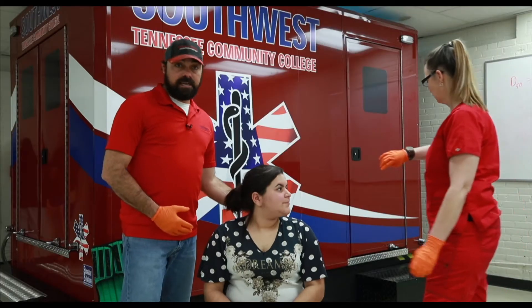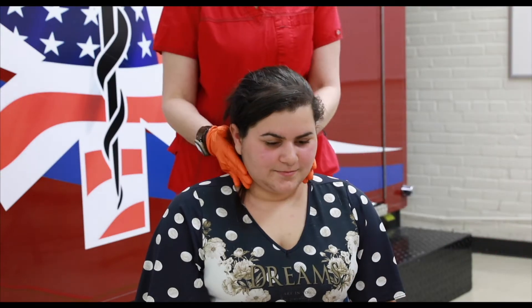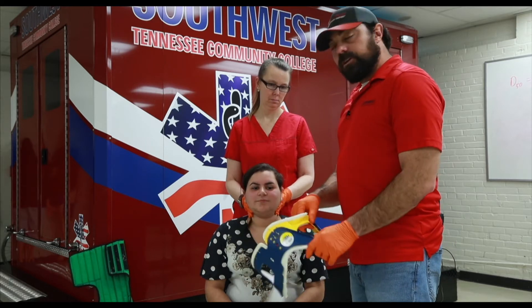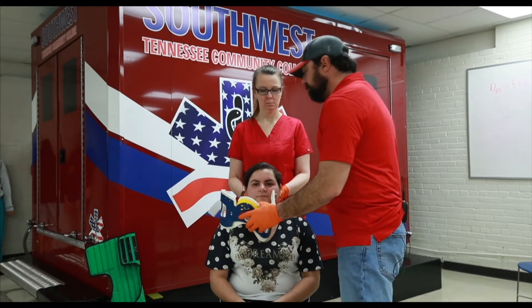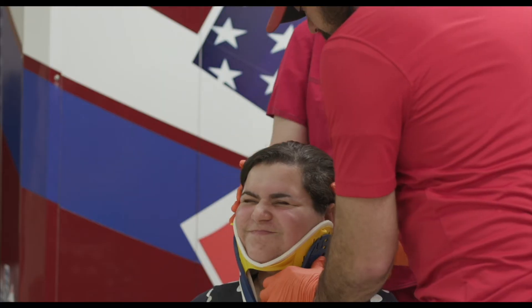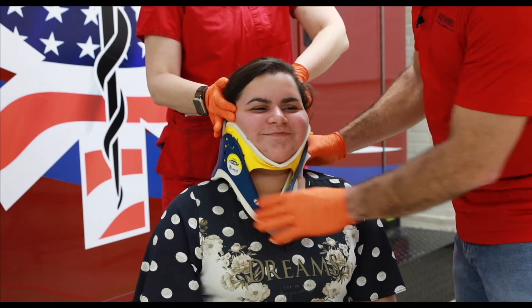You'd have your partner hold and maintain manual stabilization of the spine — getting into the C-spine position and holding the patient. I'm going to go ahead and put a C-collar on. I would properly measure and adjust the C-collar, making sure it is a snug fit, but not so tight that it's uncomfortable. Checking that the patient can breathe fine.